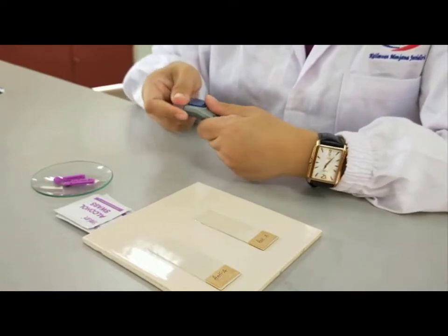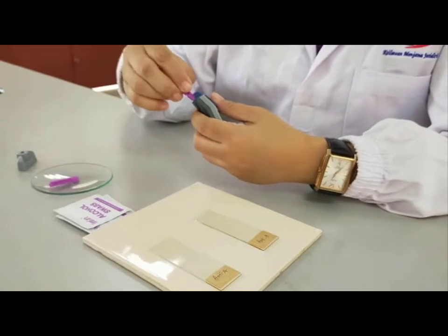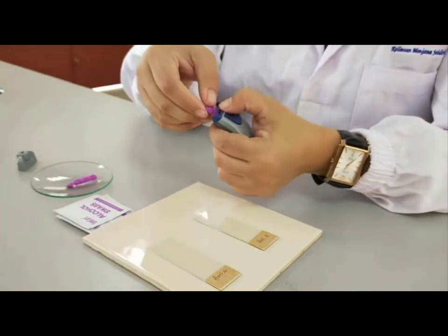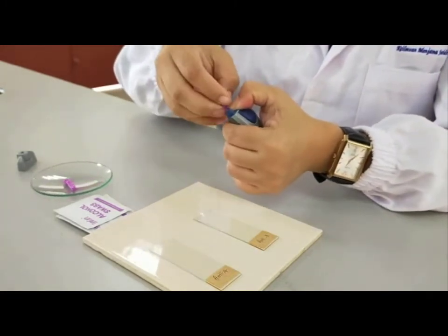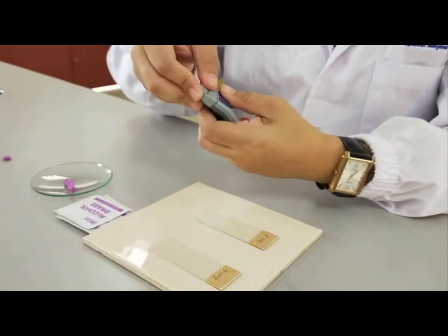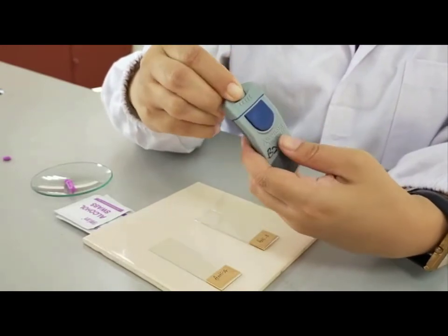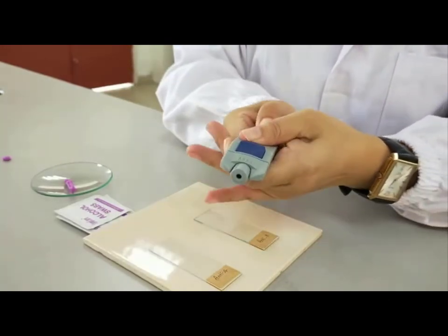First take off the cap, put one of the sterilized lancets inside, twist the cap and remove it. Put back the cap to the lancing device and set it by twisting the setting to the maximum and pull the lever at the bottom.